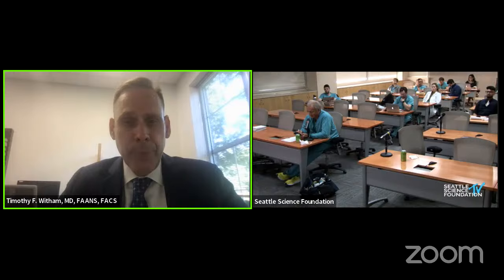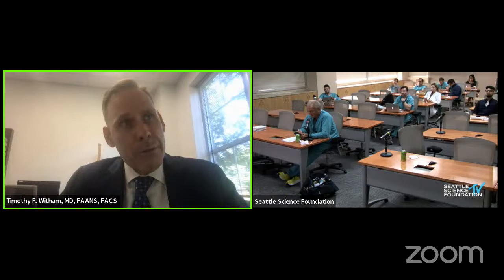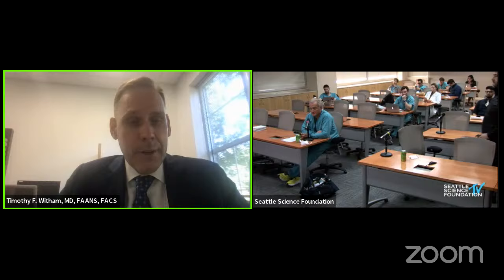One of the other things you probably should do, which we did in this case for our data, is always have an independent radiologist review it. The breach is not determined by us. It's determined by the radiologist. So outside of that, I'm not so sure there's a lot else that you can do. As you mentioned, you are sort of a champion of what you're doing, but I think again, the screws aren't going to be the most important thing. Most people can figure out a way to put screws in accurately. Yes, you're going to have a few that miss with any technique, but I think the future is going to be using the technology for other things, like you demonstrated in the prior case presentation.